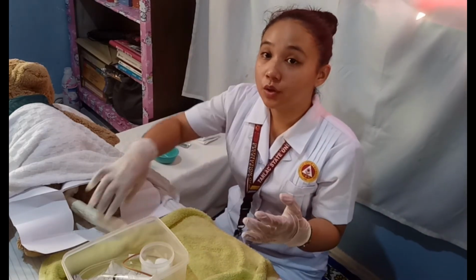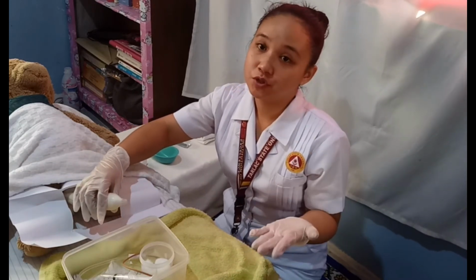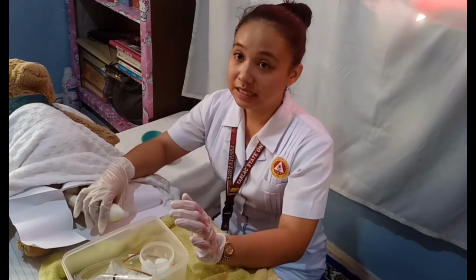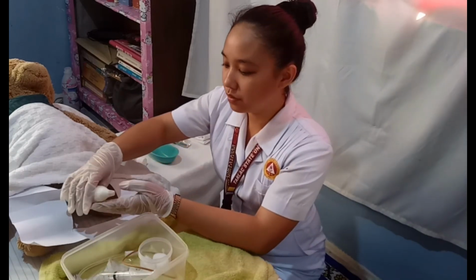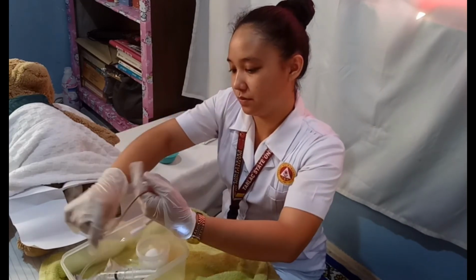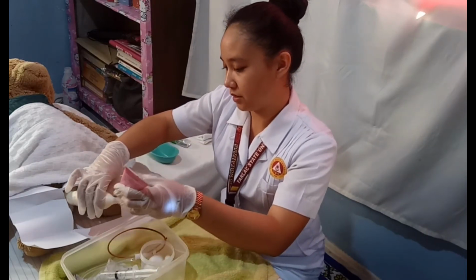Then you need to hold the penis with slightly upward tension and perpendicular to the patient's body. Gently insert the tip of the syringe with lubricant into the urethra and instill 10 ml of lubricant into the urethra. So here you go. But before that, hold on, you need to put lubricant in the urethra.